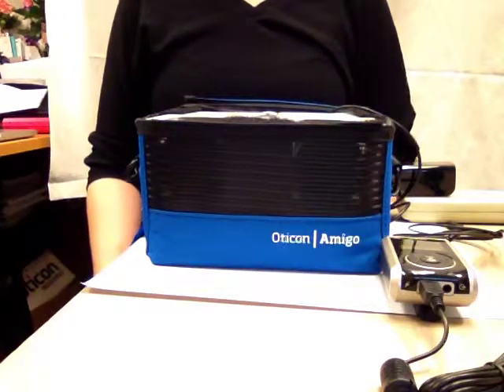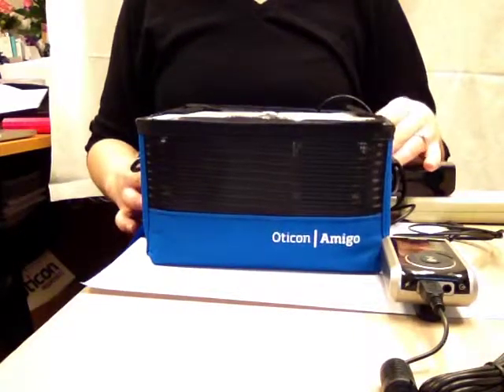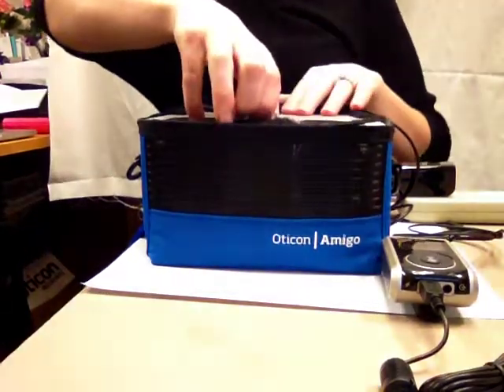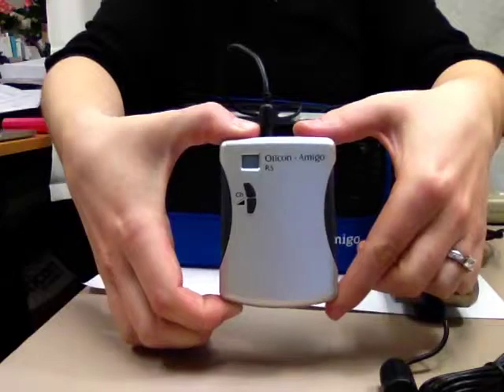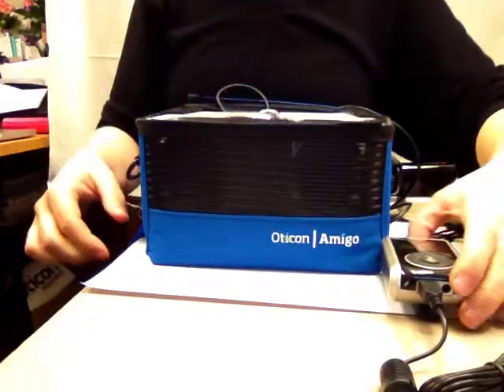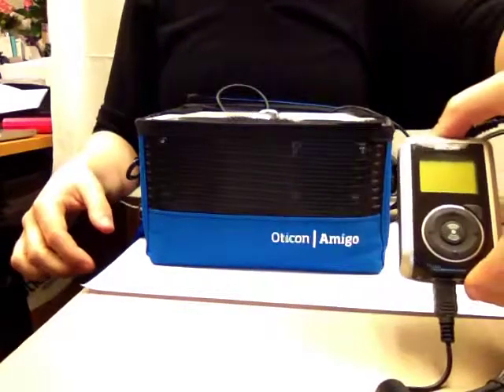This is the Oticon Amigo Desktop speaker. This is the Oticon Amigo R5 receiver that goes in the desktop speaker box. And this is the Oticon Amigo T20 transmitter.